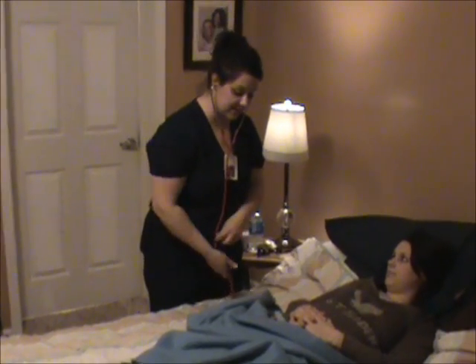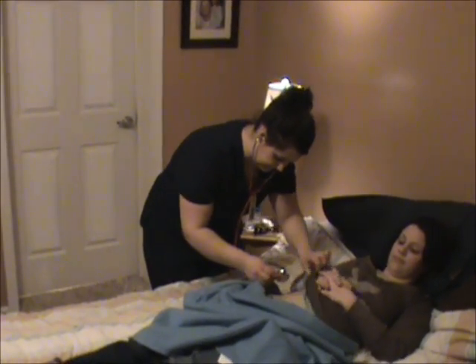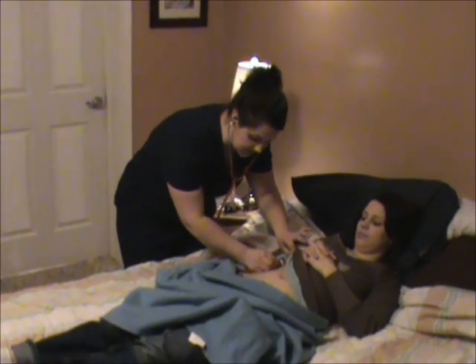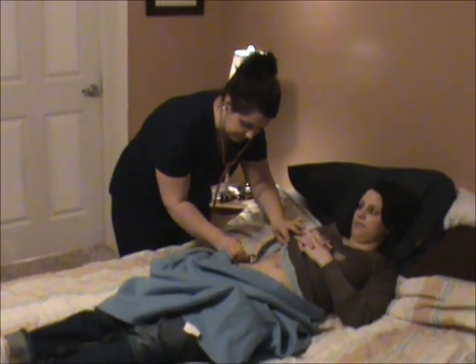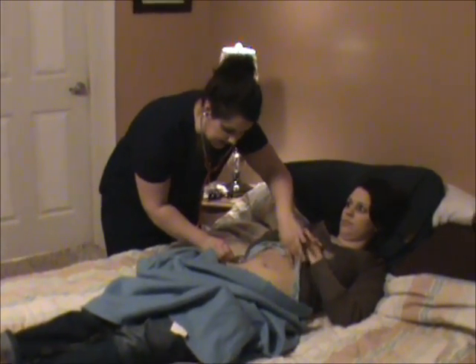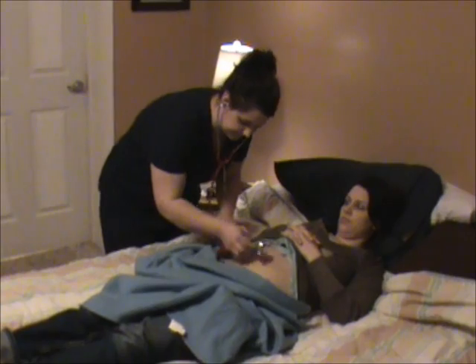Alright, and now I'm going to go to her abdomen, and I'm going to start by auscultating all 4 quadrants. And I want to listen to any abnormal sounds, such as if there's hypoactivity or hyper.